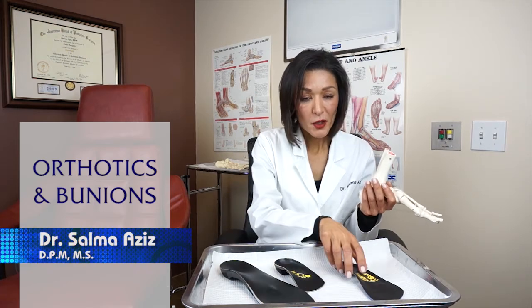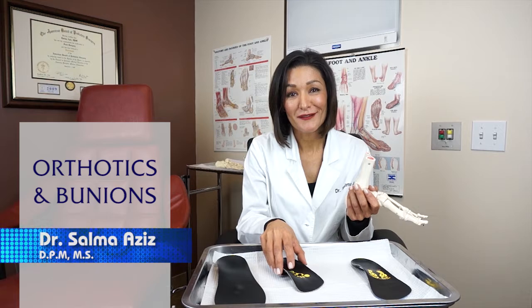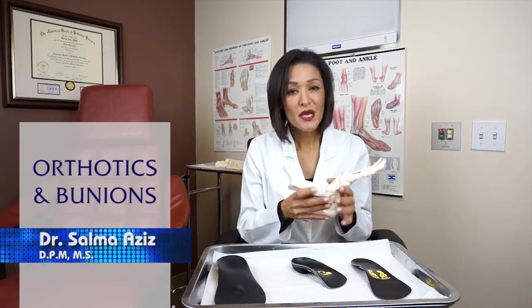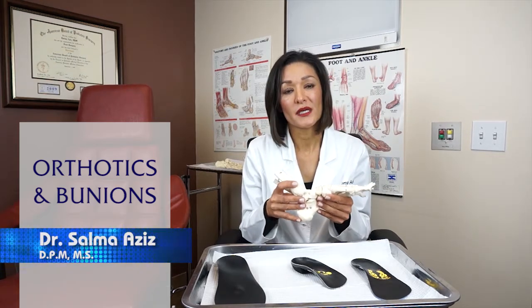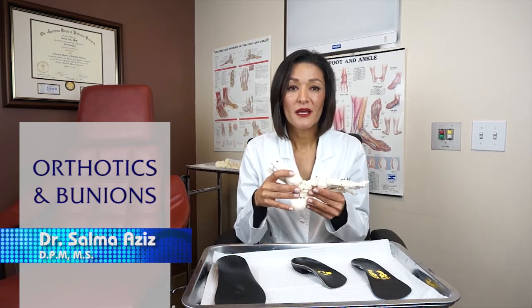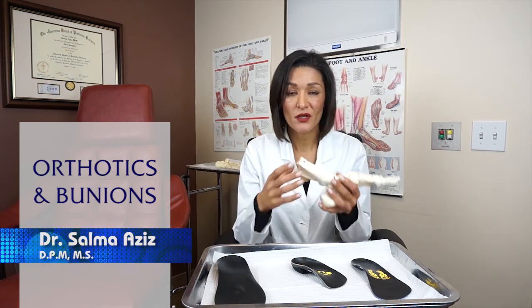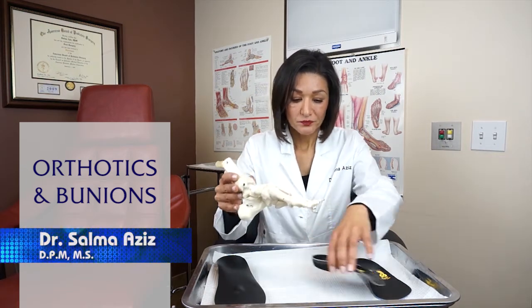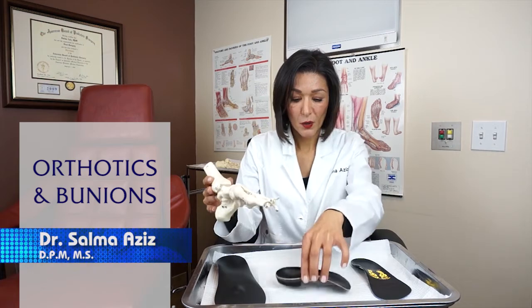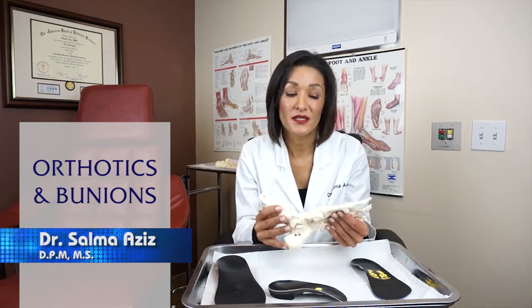So when we talk about bunions, if you had the pleasure of seeing my information on bunions, we talked about how a bunion deformity is basically genetic, and it has to do with the abnormal mechanics of the foot and ankle that genetically was passed on to the person. So to just use the 3/4 length, how an orthotic helps to prevent a bunion is as follows.